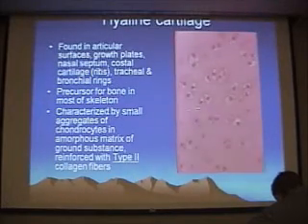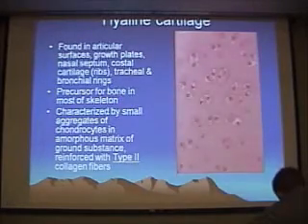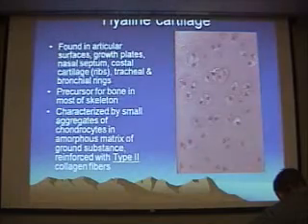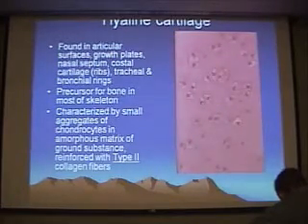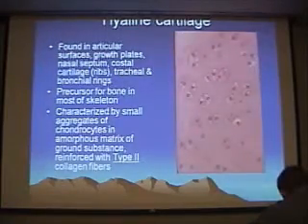And remember, this is the first type of cartilage, hyaline cartilage, which has a very glass-like appearance. So when you look at hyaline cartilage, the background matrix looks kind of like pink frosted glass, and it's reinforced with abundant type 2 collagen fibers.